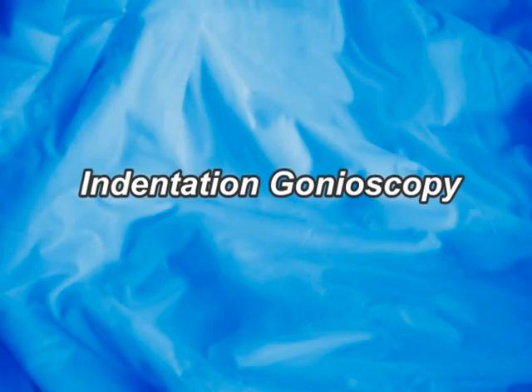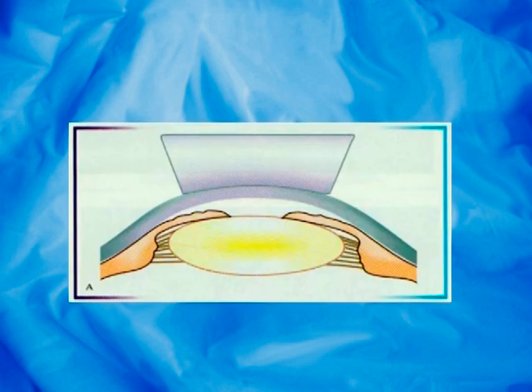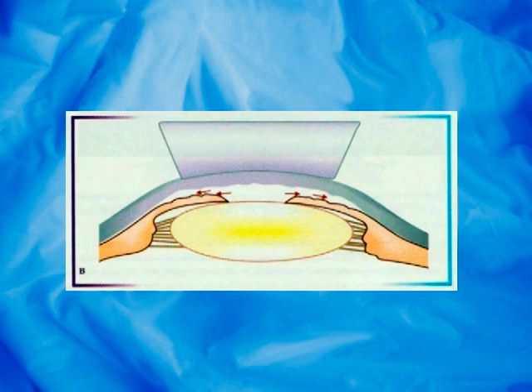Indentation gonioscopy differentiates appositional angle closure from synechial angle closure. This is done using a corneal type of goniolens. Here we can see the angle is not initially visible. The corneal type goniolens is pressed against the cornea, which displaces aqueous into the angle — the angle becomes visible in appositional angle closure but not in synechial angle closure.